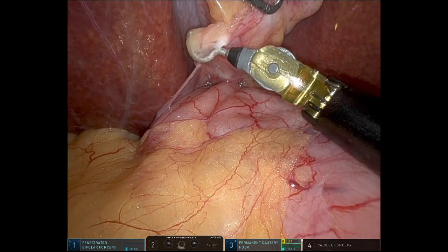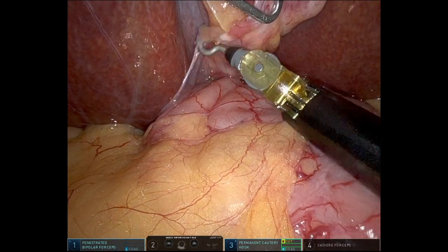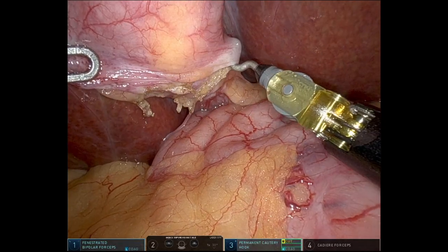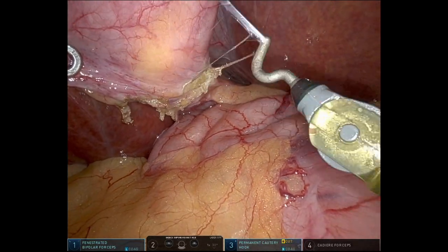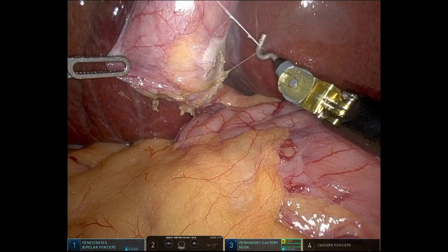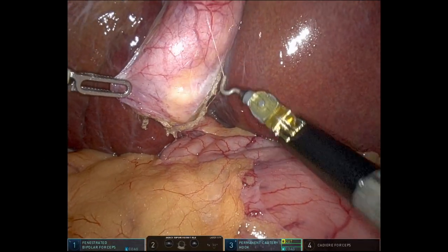So he started with the lateral dissection. Here he's trying to dissect medially, but there's no way he's going to see the medial structures well unless he turns the scope on its side.